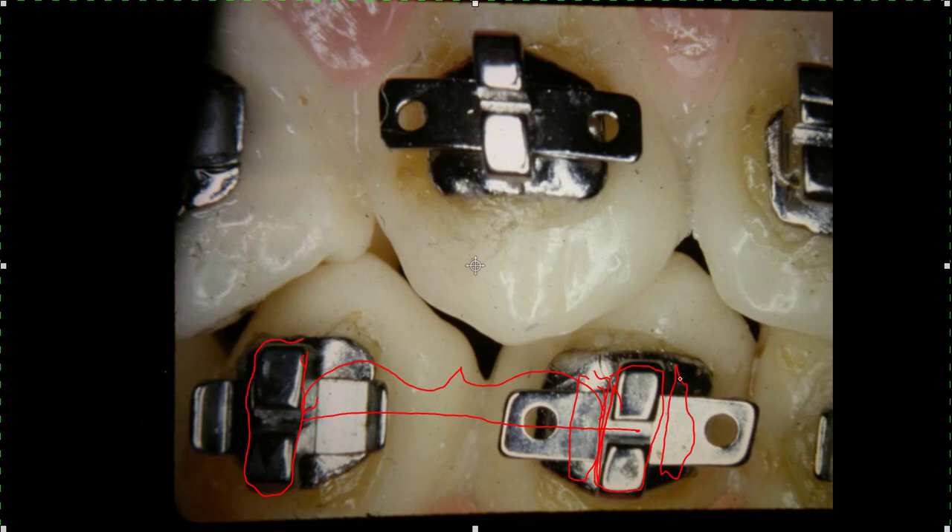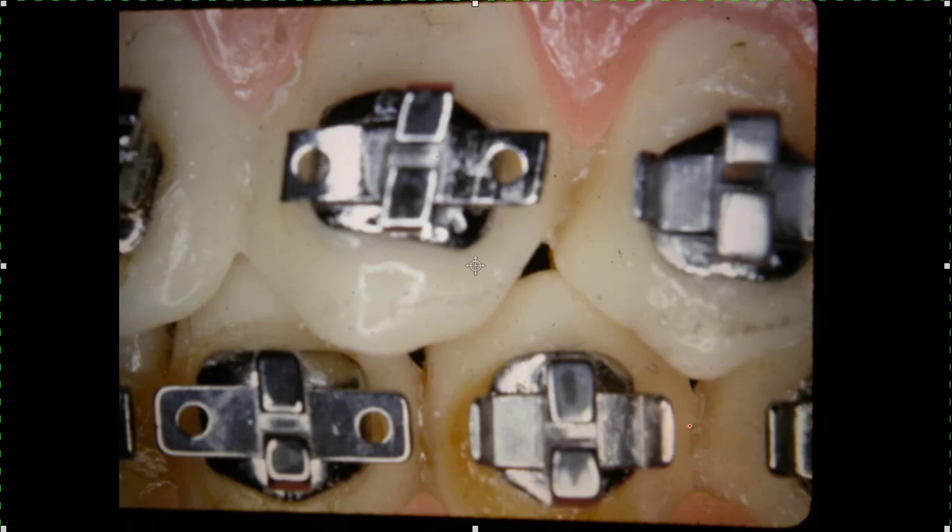We've gotten to where we use just a single bracket with a vertical slot. It's harder to rotate with, but we know how to rotate with them using wedges and different things. You can bend the wings up. Looking at them close up from a different angle, you can see how the tip is built into this bracket - that shows a real nice illustration of that.